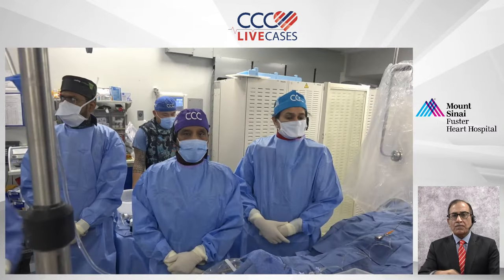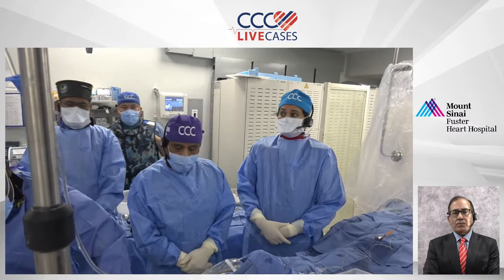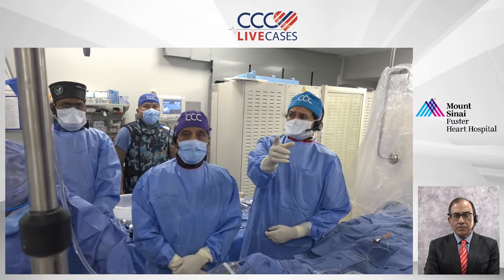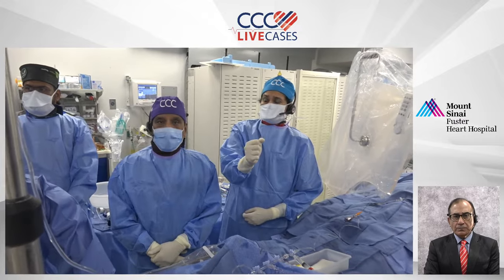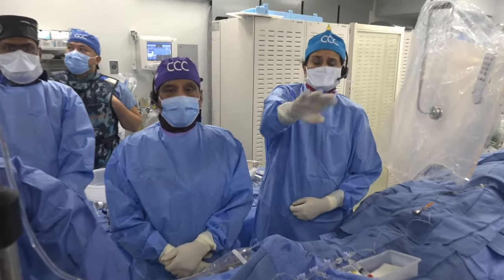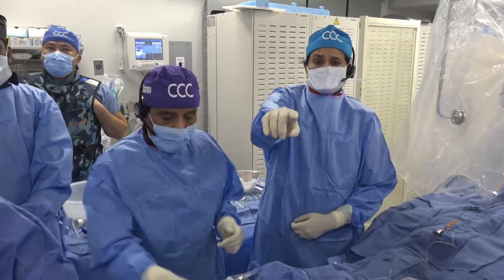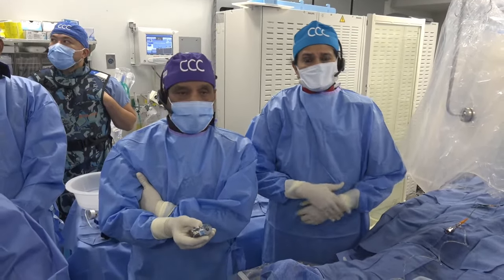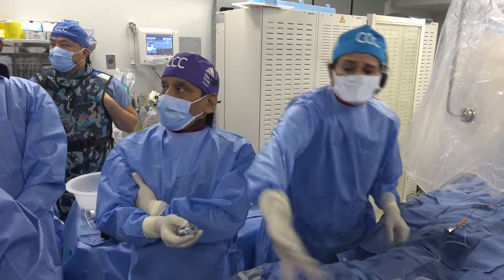And this particular case is the first of its kind where we'll try to do a two major side branch involved. In this particular case, and how we are going to deal with it with a mini crush technique or we do a step crush, we'll see. So with that note, we start our presentation. Let's go to our slides.